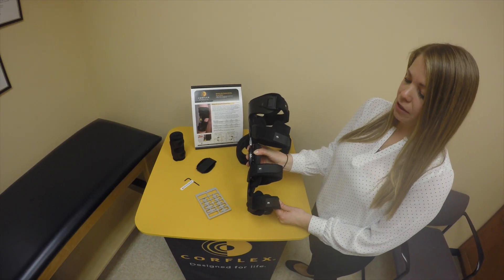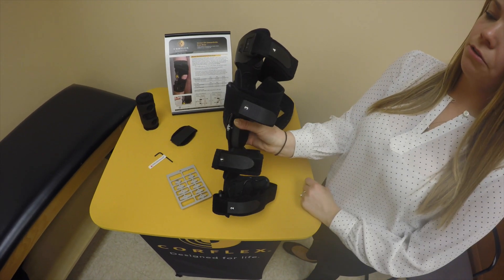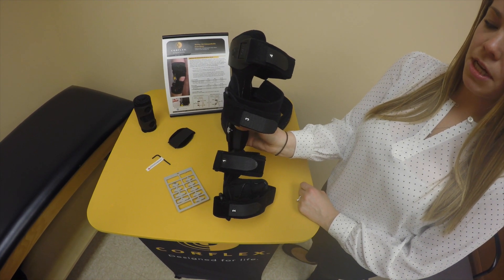Each strap on the Stride OA is numbered with a sticker on the edge of the straps: one, two, three, and four. Those are helpful to use when applying the brace in order to keep it suspended.